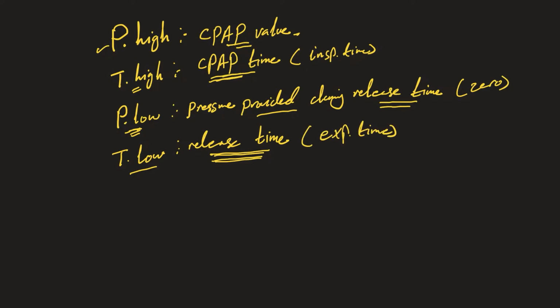So these are the values you have to provide every time you put a patient on APRV mode, plus of course the FiO2, respiratory rate, and sometimes they will ask you for pressure support, because remember, the patient will have spontaneous breaths that may not be supported by this. They may ask you, do you need a pressure support? And this is similar to P low. We usually make it 0. So they will take two values out of your mind. You don't have to worry about them.